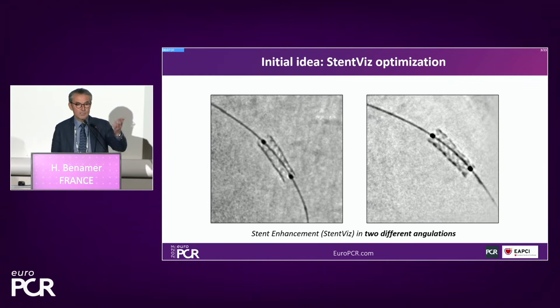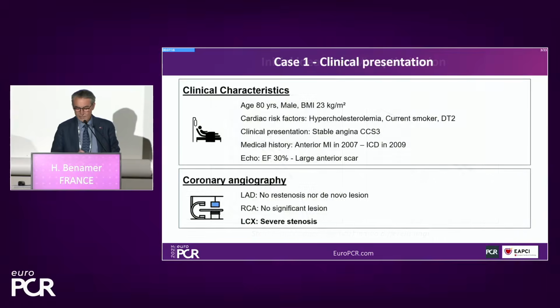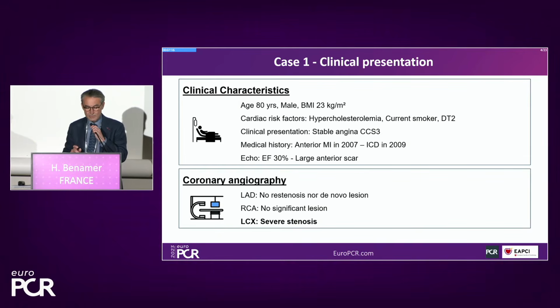That's why I discussed with the GE engineers, and we tried to improve the process to have a tool to be sure that the stent was well expanded in every view.